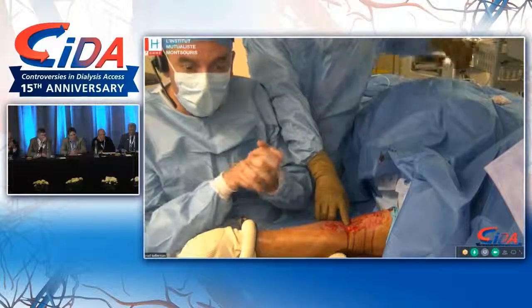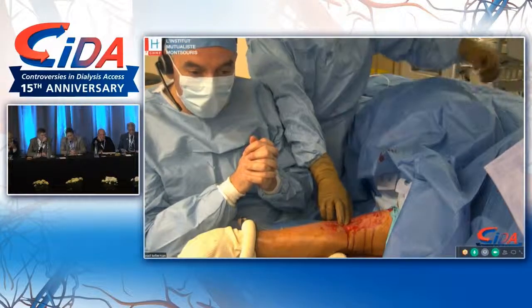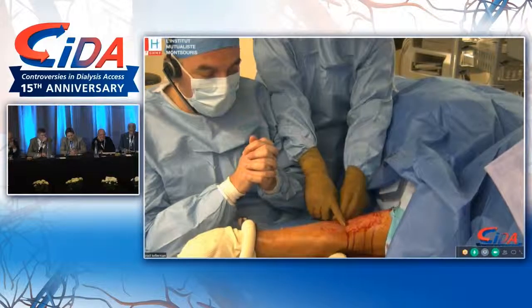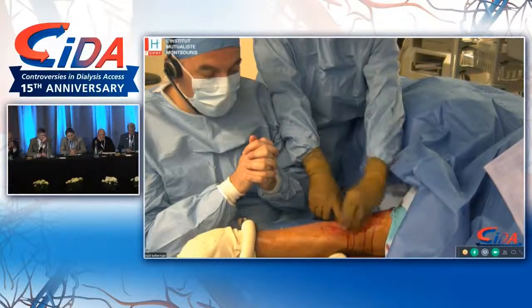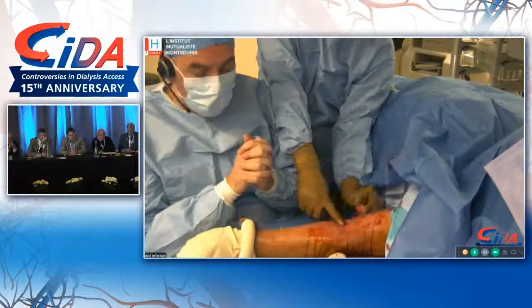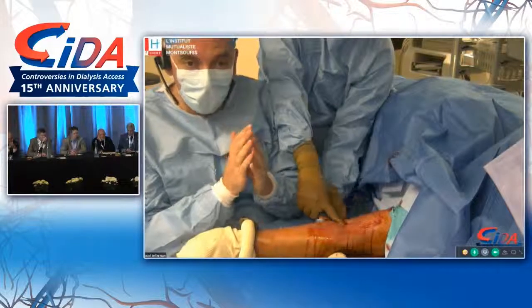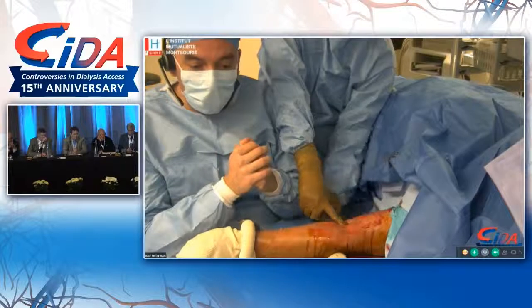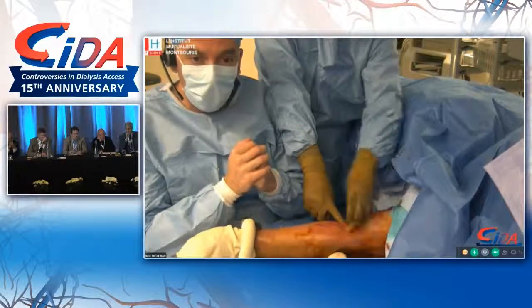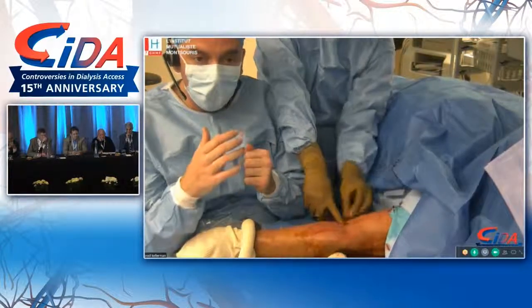Somebody wanted to ask something? Hey, Alex, it's Eric Beaton. That was really spectacular. Question to you is, do you ever add in embolization of the deep vein to try and encourage the flow superficially, or is it not needed? Okay, so I never do this as a part of the creation. I will avoid doing a patient that has a big radial or a big brachial vein, because I know that it will take the whole flow. So I will avoid these patients.